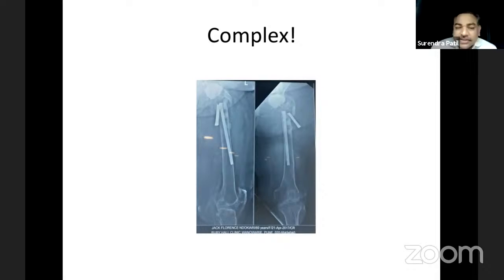No, same thing. If the infection has settled down and the markers are normalized, we need to go for the cemented cup as well as the cemented stem. The femoral canal appears to be quite wide, so a lot of cement is going to be required to fill it. But I think a long cemented femoral stem along with the cemented acetabular component should be the answer for it.